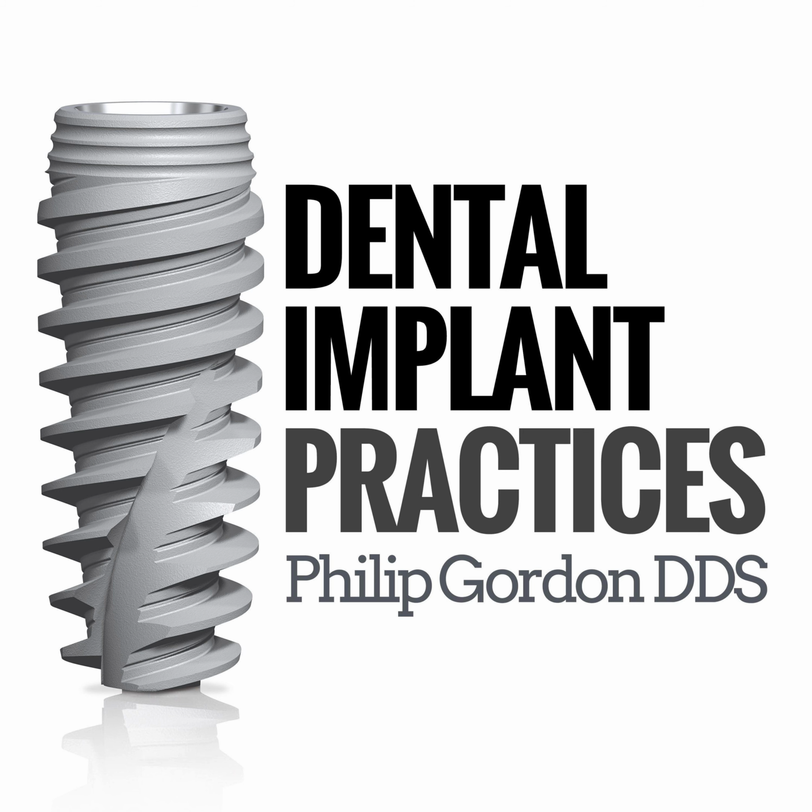I'm creating custom healing abutments to help contour the tissues when I place implants. So rather than just putting a round healing abutment in place, especially in the anterior, if we can't do a provisional, we're doing custom healing abutments that really help form and shape and support the soft tissue.